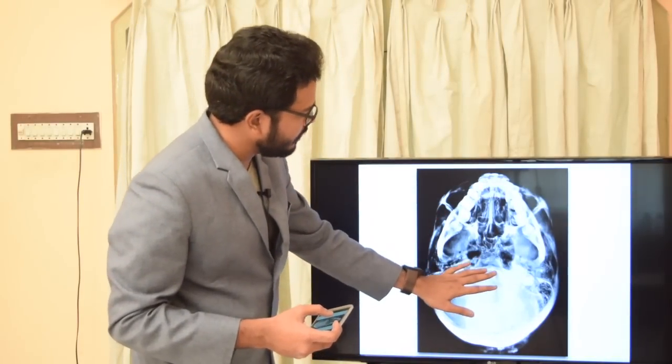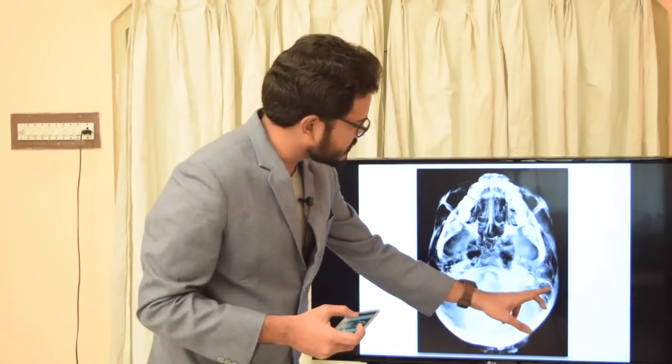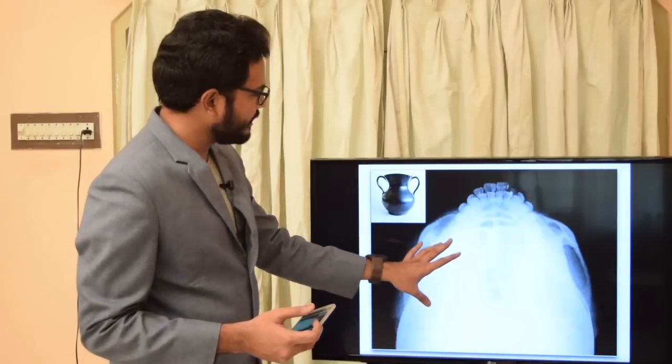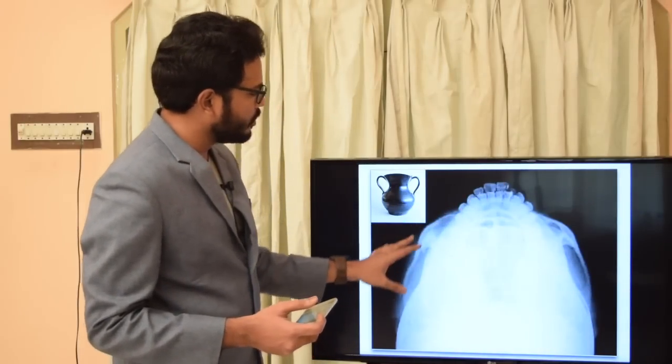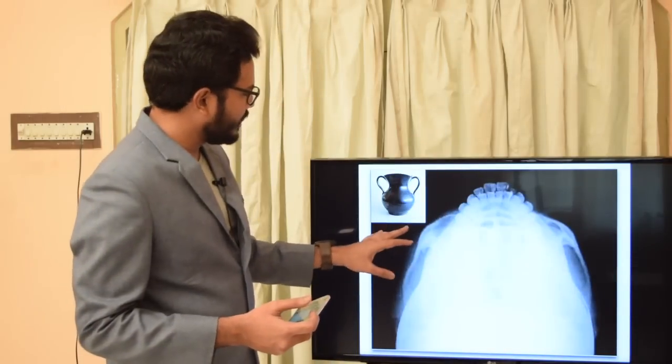This radiograph depicts the submental vertex view, where we can clearly visualize the base of the skull, the inferior border of the mandible, and the zygomatic arches. The projection is called submental vertex as we project an x-ray beam from the mental process of the mandible towards the vertex of the skull. In another radiograph, the exposure has been reduced to one-third to make zygomatic arches more prominent.